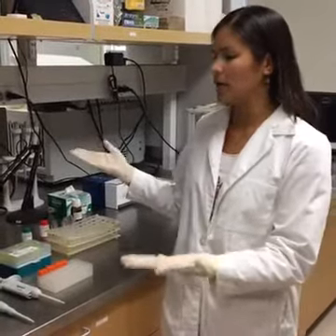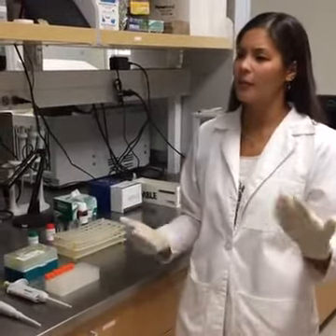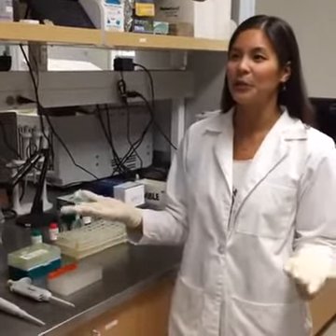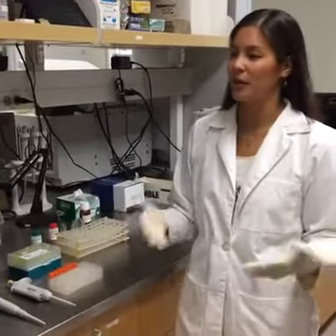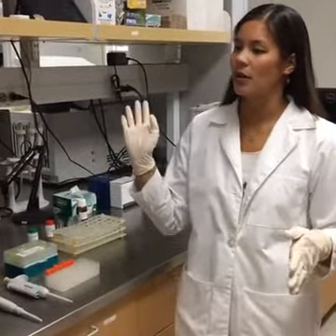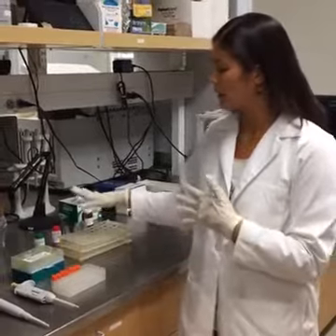We have these kits that are already produced by different companies, and they send them to us, and we just put in our blood samples. It's almost like baking a cake. There's a recipe to it, and we just add things in the correct order. We give them the right incubation times instead of bake times, and then we can read them later with specialized computer instruments or other readers that can measure whatever enzymes or isotopes we put in here.